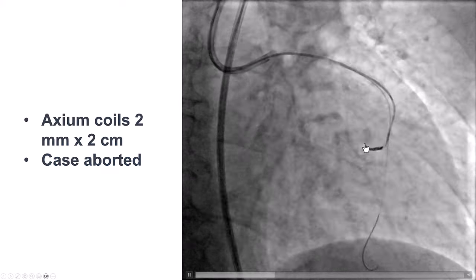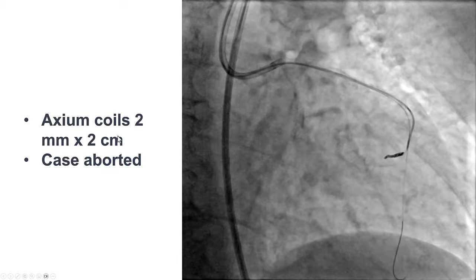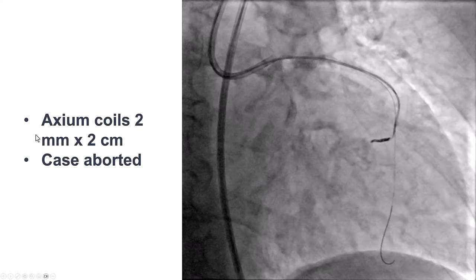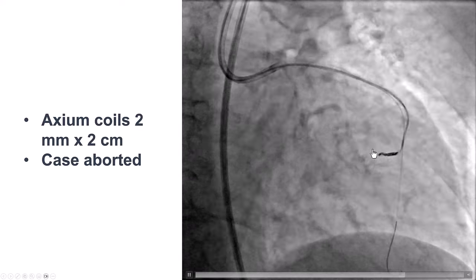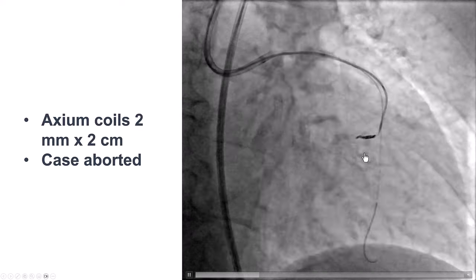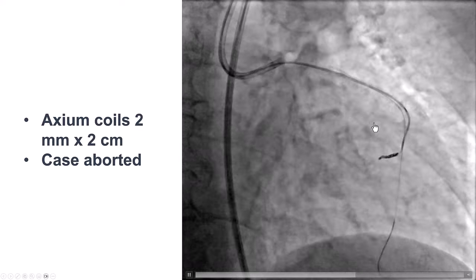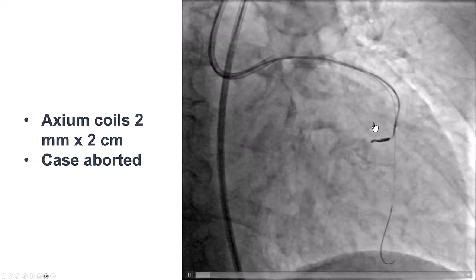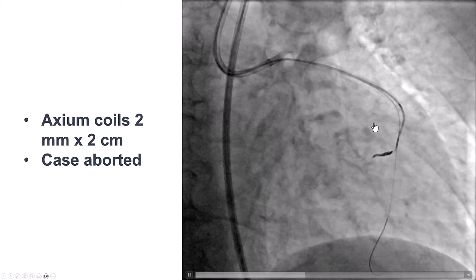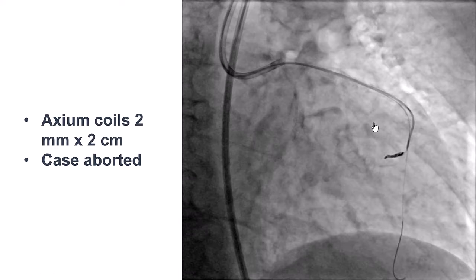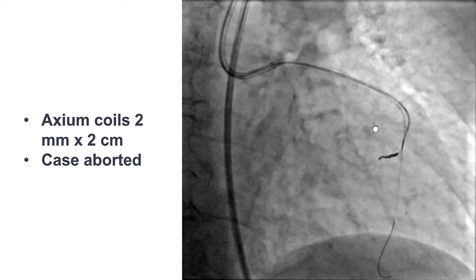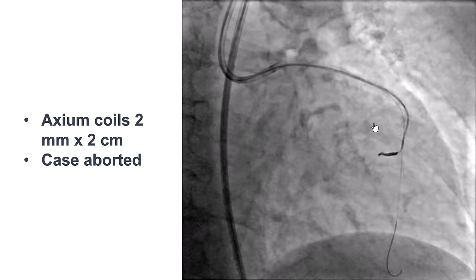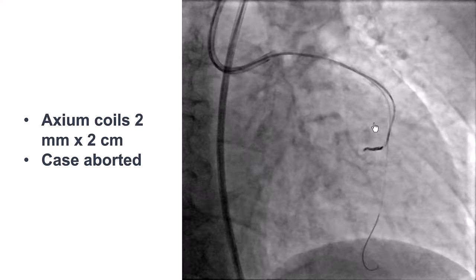We deployed a 2 mm by 2 cm axiom coil into that branch and stopped the case. In case of complication, it's always best to stop the case, let the patient recover, and then try again.